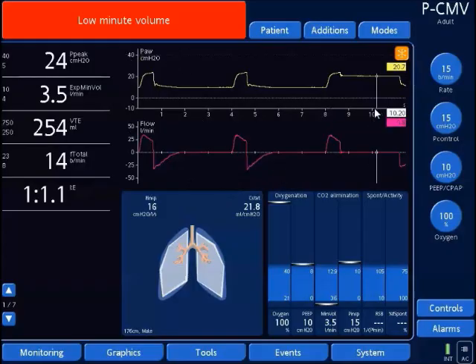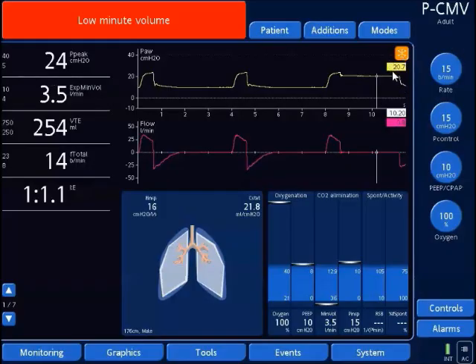As you notice, the screen is frozen, and we'll look at this control arrow that's used with the control knob to scroll over and actually measure the pressure. From this example, the plateau pressure is 20 and the peak pressure is 24. You see that measurement of 20.7 — that's the actual measured value based on where the cursor is placed on the waveform itself.